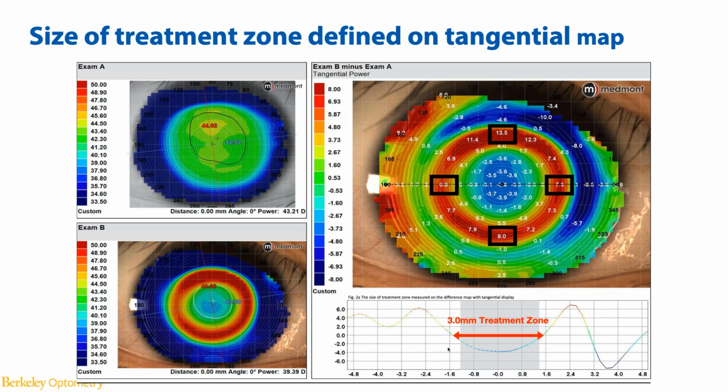So it's a very dramatic difference depending on which display environment you use in analyzing the data. And for this study it is less concerning because we're comparing the same subject, same eye, 2 different designs. So as long as we're using a consistent display for the analysis, it still shows a pretty valid comparison.